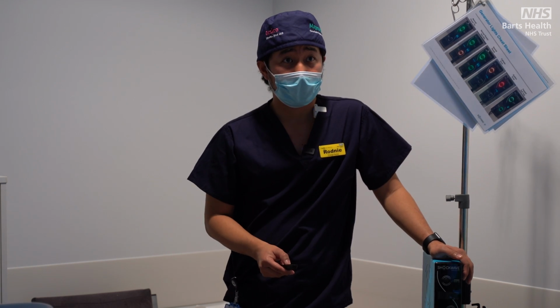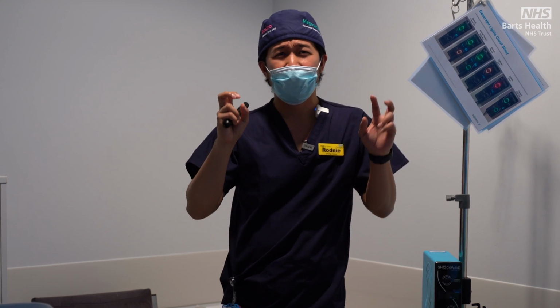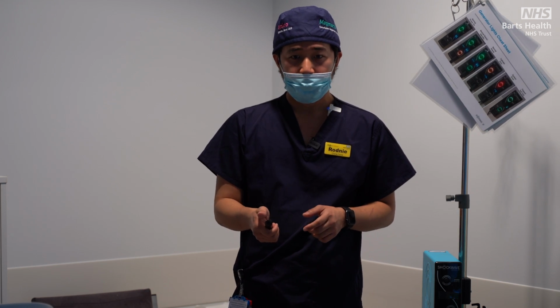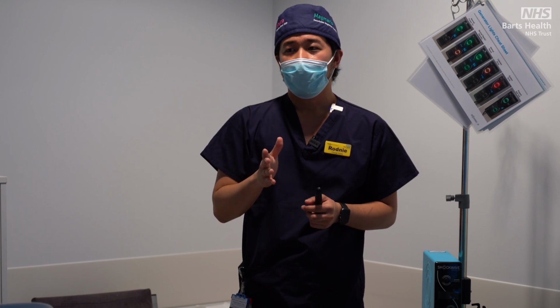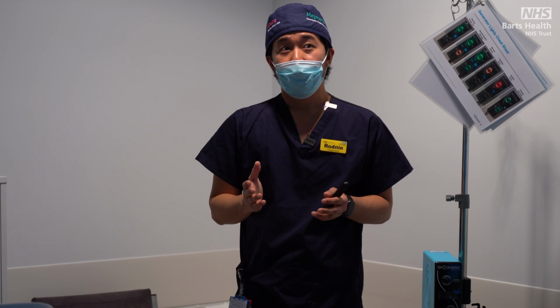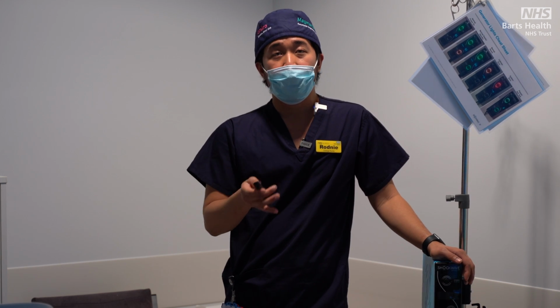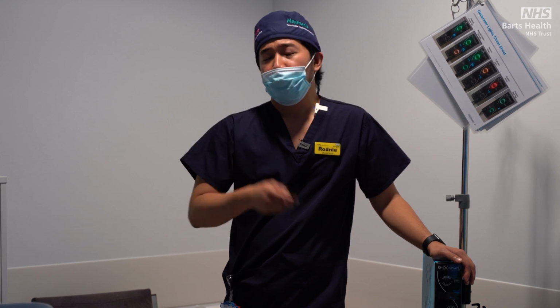Is 10 seconds the standard? How long is the shockwave? So the balloon has 8, they call it therapy. So one therapy consists of 10 pulses and 1 pulse per second. So when you press the cable catheter, it gives 1 pulse per second. And then after 10 seconds, it shuts off automatically, which gives the doctor a signal to deflate the balloon, so that you give the heart a drink. But can you do it longer than 10 seconds? Can you do it again? Yeah, you can do it again. So after one therapy, 10 seconds, give it a shot or a drink for like 30 seconds, and then you inflate again.